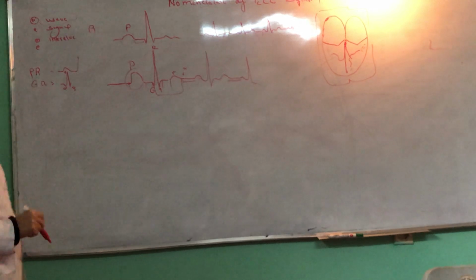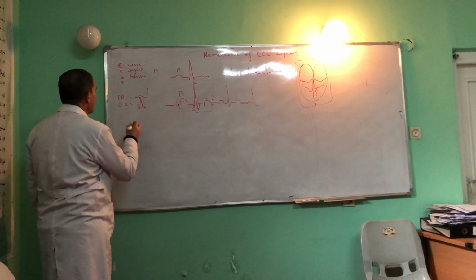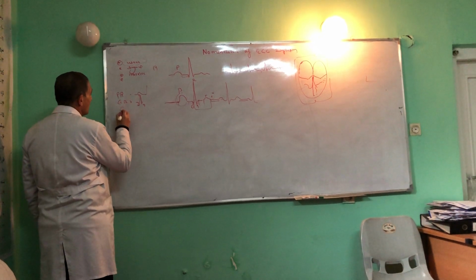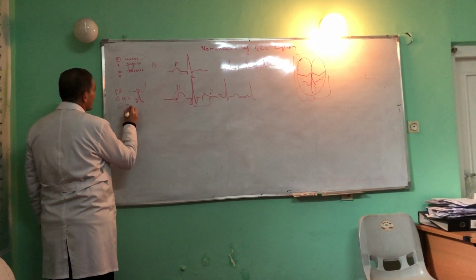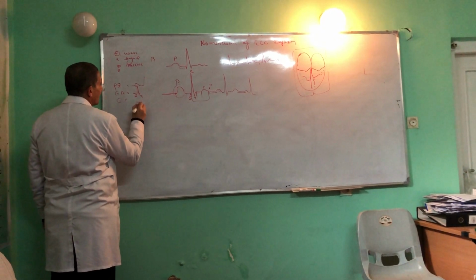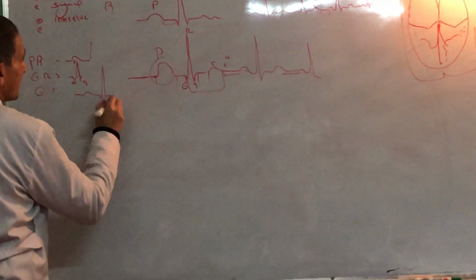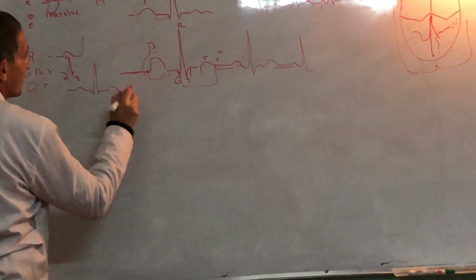Now this is the PR interval, QRS interval, and QT interval.